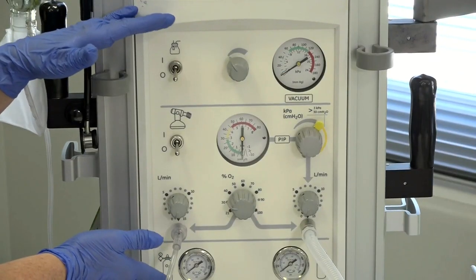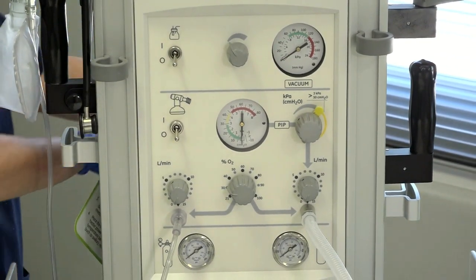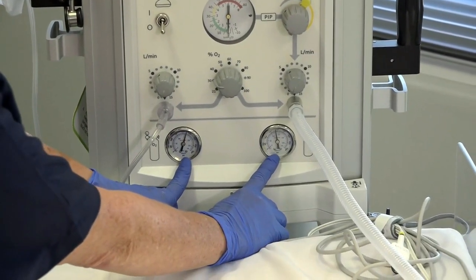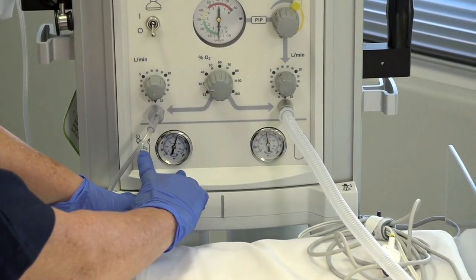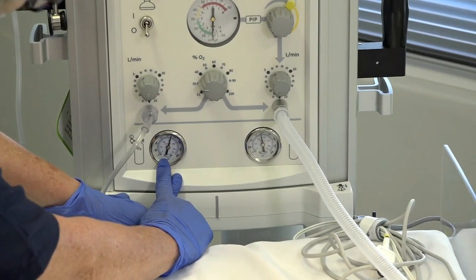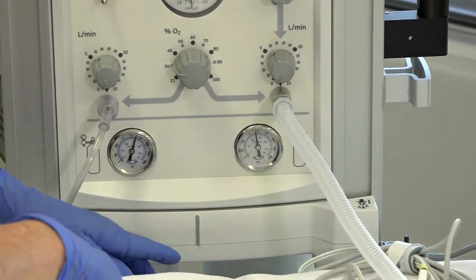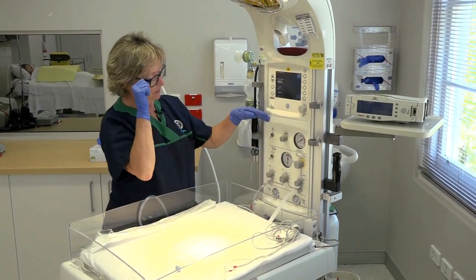The T-piece ventilator is gas dependent, so we need to turn the oxygen on, which is at the back of the column. We are very fortunate — it's visible at the front. We can see the level of the oxygen cylinders, and that's certainly more than three-quarters full, so we're happy with that. The first part we will check is the suction, above the dial.